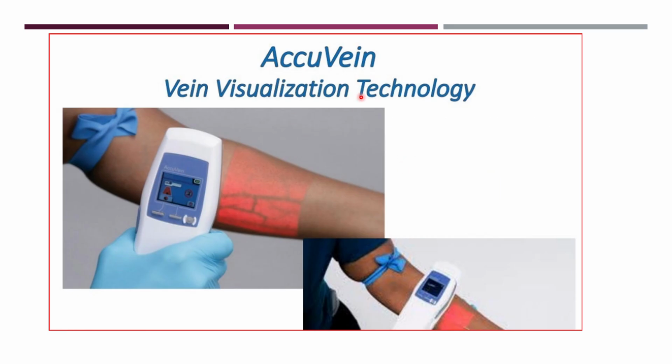This is one new technology which provides visualization of the vein inside the skin layer. In some patients, it is very hard to visualize the vein because they have very small veins, or you are not able to locate the vein. At that time, you can use this device to visualize the veins.